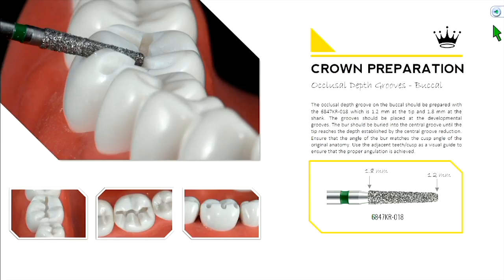The 018 stands for how wide the burr is at its shank — 1.8 millimeters. For these tapered burrs, as you go down toward the tip, it always converges to 0.6 millimeters less than the original shank width. So in this case it's 1.2 millimeters at its tip, which is perfect because we want our buccal margin to be 1.2 millimeters. Right at dead center of that burr is about 1.5 millimeters, so you can use this burr as a gauge as you reduce.